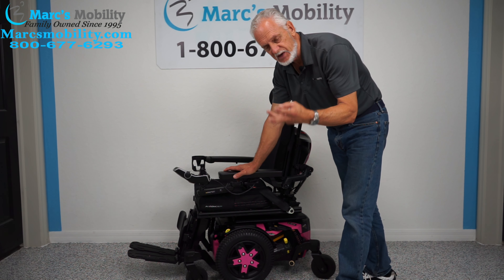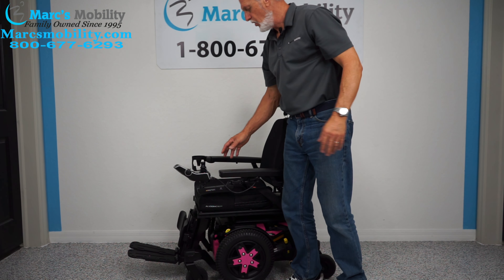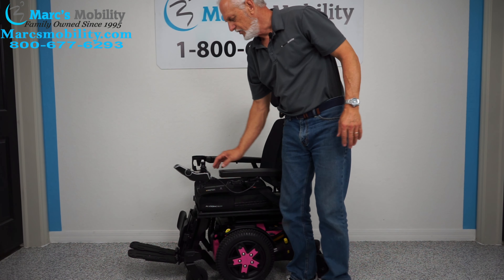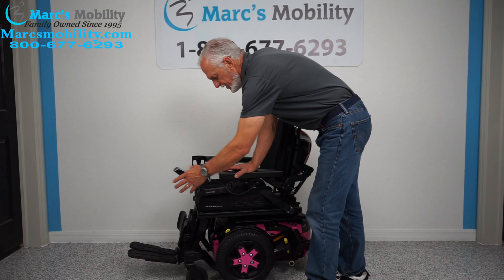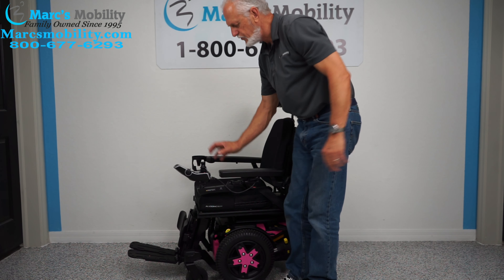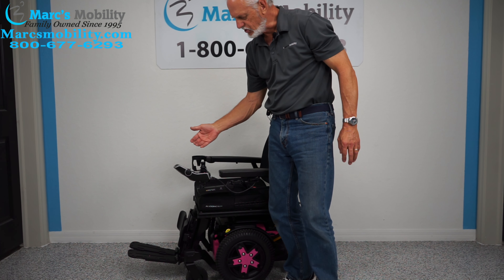It has three functions: electric tilt, electric recline, and electric feet. All the functions on the chair have to be worked through the joystick. Keep pushing the knob forward until you see a picture on the screen — whatever is yellow, that's the active function.